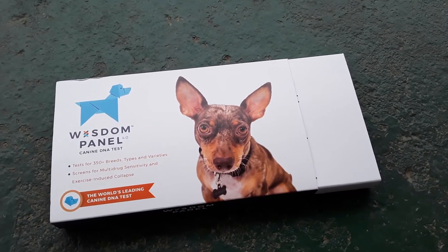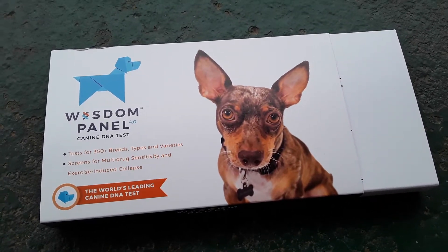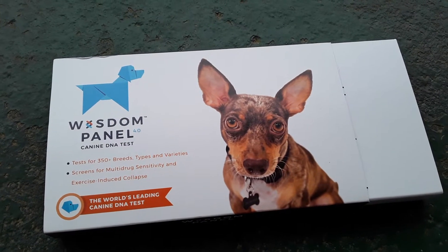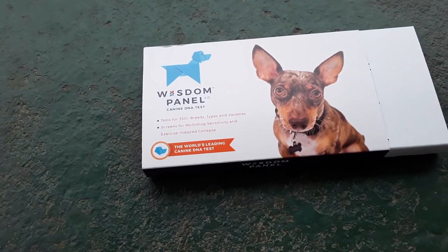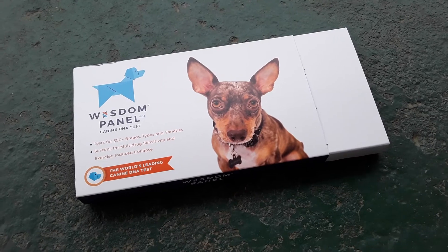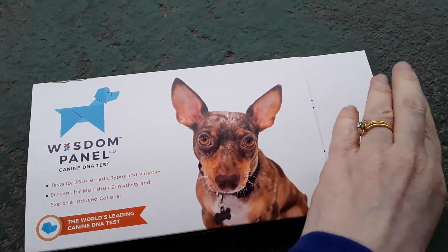Hey everyone, I am here today to show you about my Wisdom Panel canine DNA test. This is 4.0, their newest one, and it tests for 350 plus breeds, types, and varieties. It also screens for multi-drug sensitivity and exercise-induced collapse. I have used Wisdom Panel in the past on my dog Rue and the dog we used to have, Kanga, and we loved the results we got and were really impressed with it.